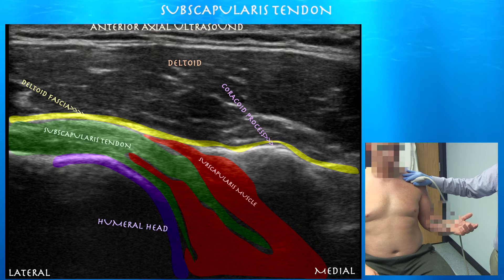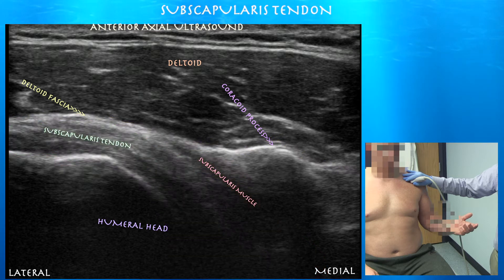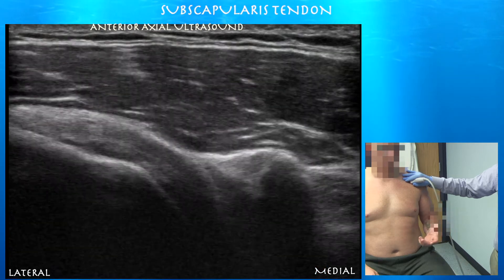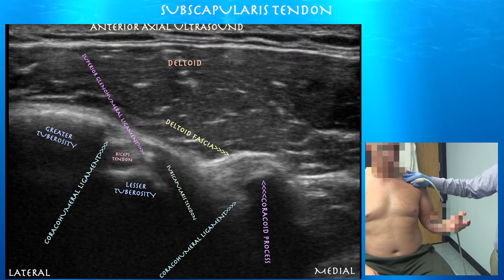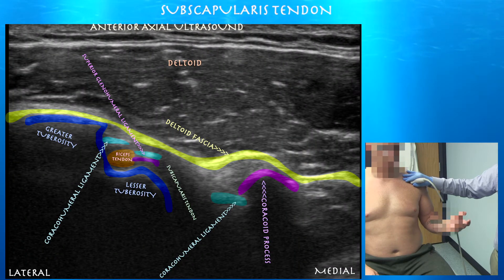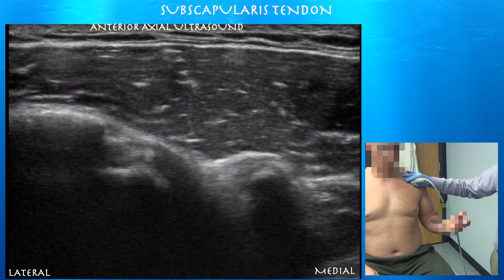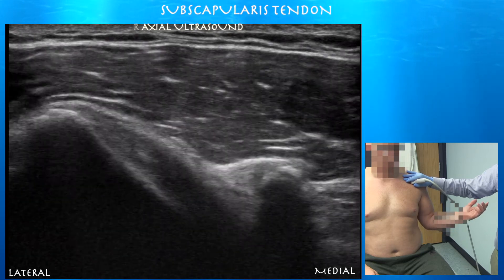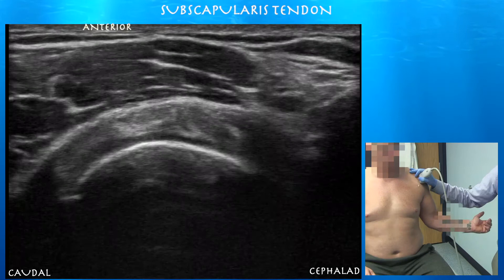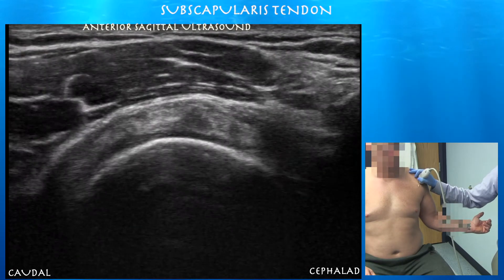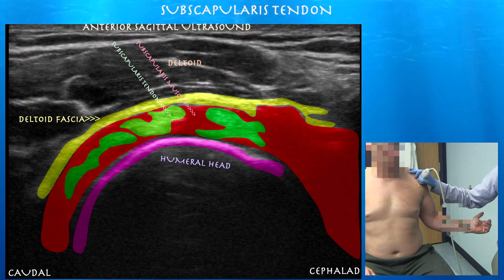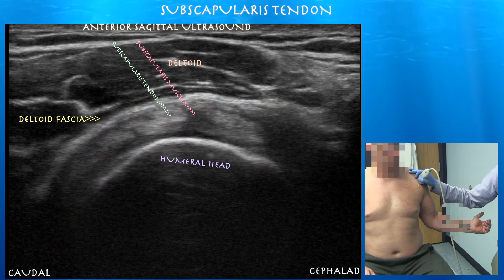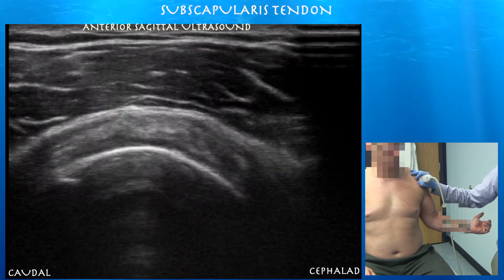Here you can see how the subscapularis muscle interdigitates with the tendon. With external rotation, you're bringing out that biceps tendon. You can also see the coracohumeral ligament that ovalized the biceps tendon. Here we're looking at a cross section — that muscle interdigitation with the tendon.